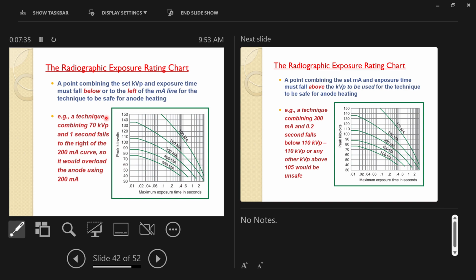So your maximum mAs is 300 times 0.2, so it's 60. Okay, 60 mAs is your maximum mAs setting when you're at 80 kVp. And every machine's going to have one of these. In principle, it's in the manual.